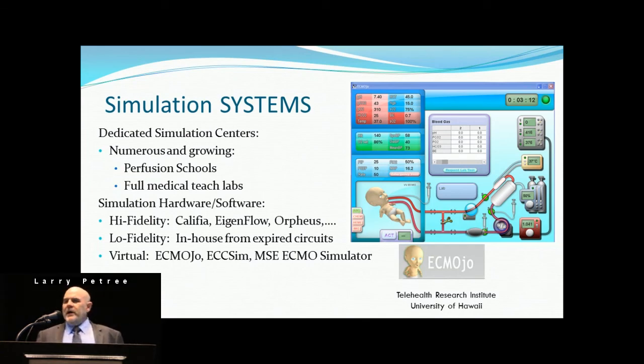There's 3 other ways that you can get simulation to benefit your practice. The high fidelity we've already talked about with the Califia, the Eigenflow. There are other systems that are out there. Low fidelity, I don't think, is being overlooked. We just don't talk about it much.